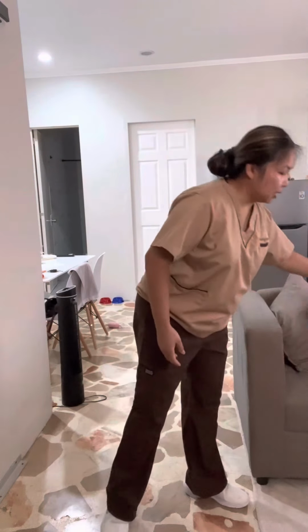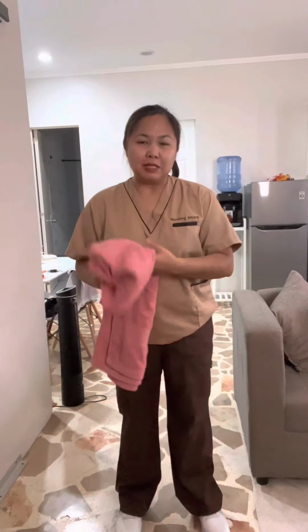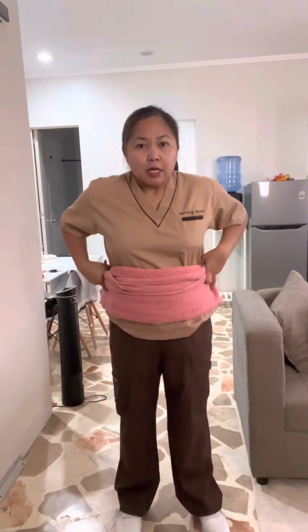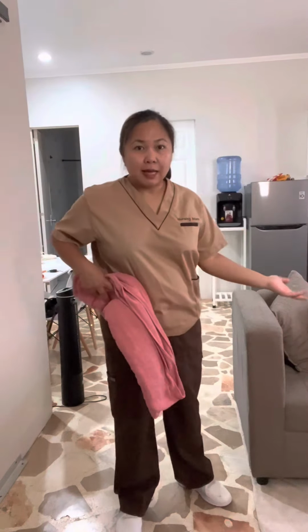And then encourage the patient to use the stand assist device or the self assist device, if it's available. Usually they could use those devices so they can pull themselves up and stand on their own. And if the patient needs a gait belt, you would like to get that gait belt for them. Let's just pretend that this is my gait belt, and you would wrap this gait belt around their waist. So let's pretend it's already wrapped, and the patient is seated in their bed.